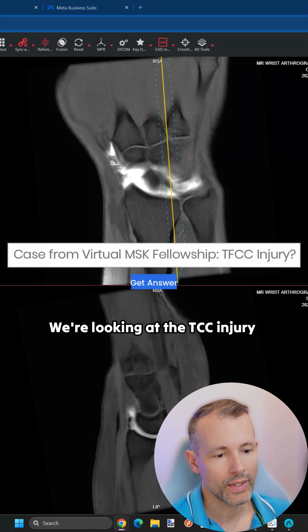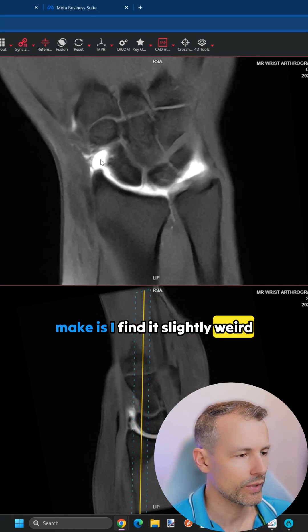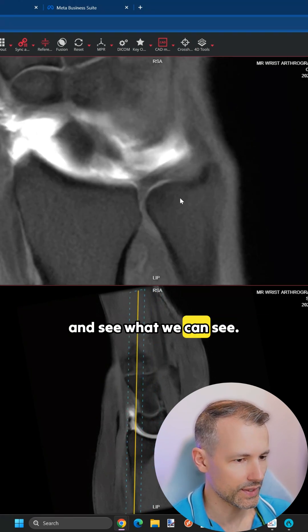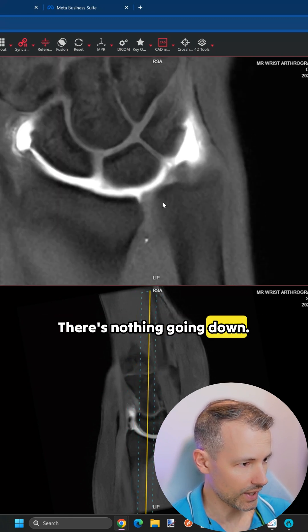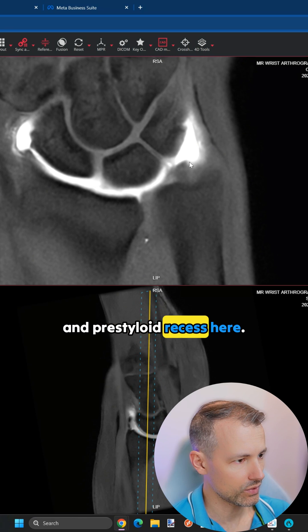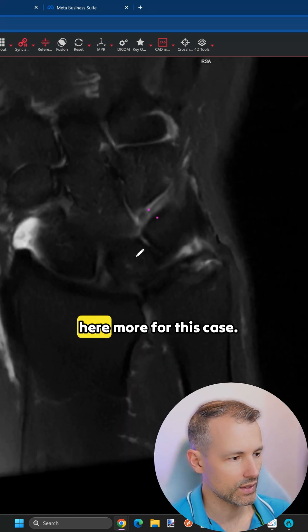Thanks for the case. We're looking at the TFCC injury question and this was an arthrogram. The first comment I would make is I find it slightly weird that the radiocarpal compartment was injected only — I would have preferred a first distal radioulnar joint injection to see what we can see. When we look here, we can see the surface is intact, there's nothing going down, so we don't have a communicating injury. At the periphery we can see the meniscus homolog outlined nicely, and the prestyloid recess here with no contrast leaking into the attachments. So we have to rely on the PD fat-sat for this case.